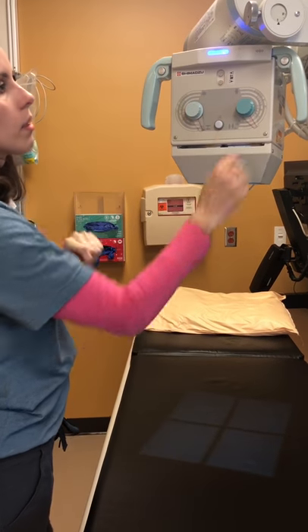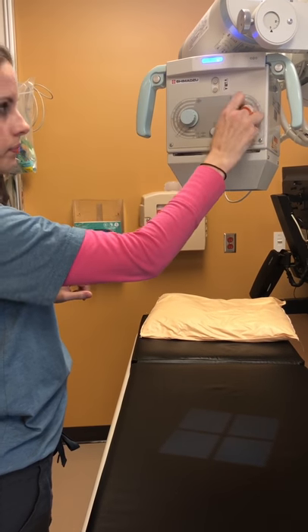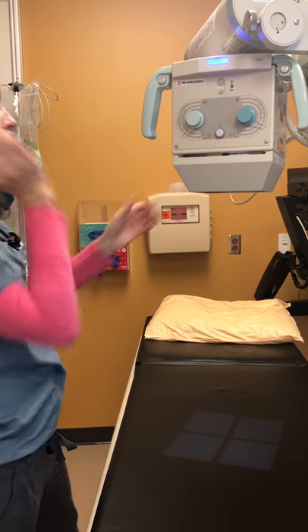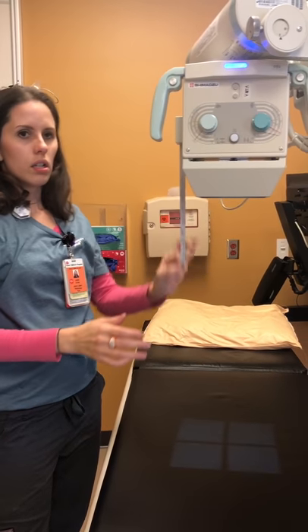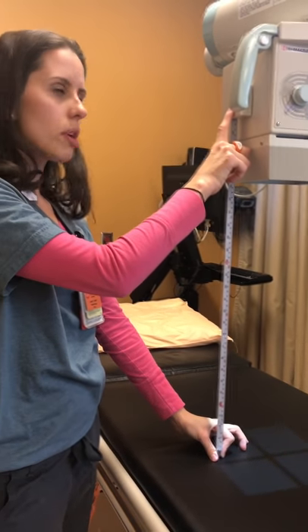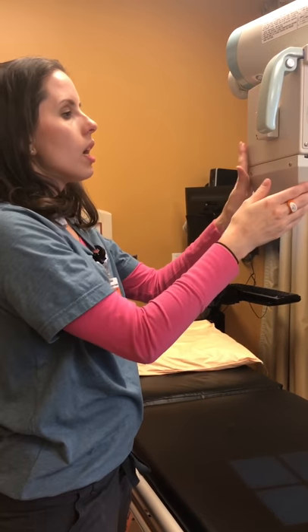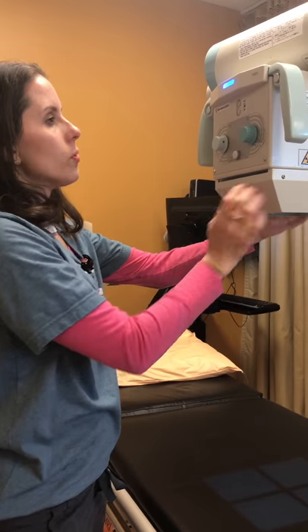As you can see, the collimator dimensions are here — easy to use, easy to manipulate. The tape measure is located here on the side of the Shimadzu portable, very easy and handy to use.